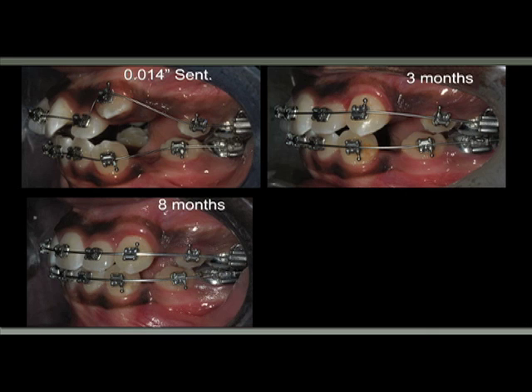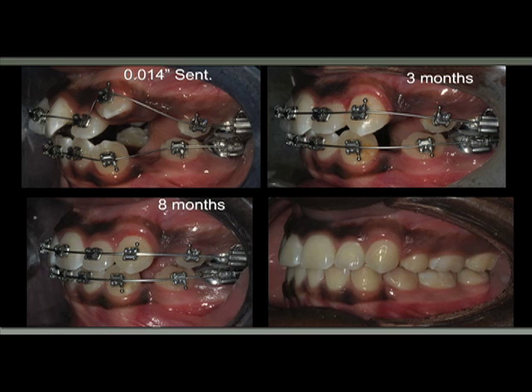Then after 8 months I have the 20 by 20 bioforce with the arches level and aligned completely, the space reduced, and we are ready to go to the next step, stage 2 working stage. And of course here is the finished case. Important is to notice the distance between the upper canine and the premolar. See how the wire is getting smaller after the alignment is done. So all the extra wire has to go somewhere, and it usually goes back.